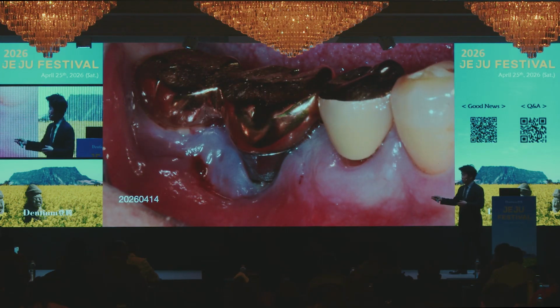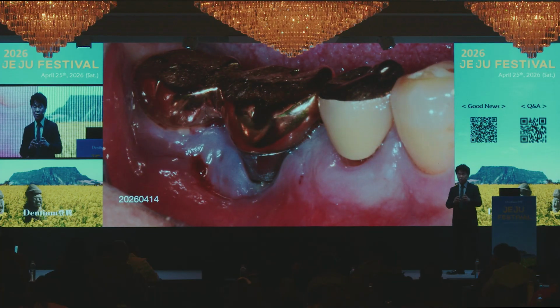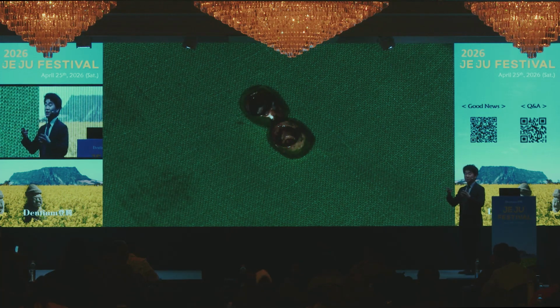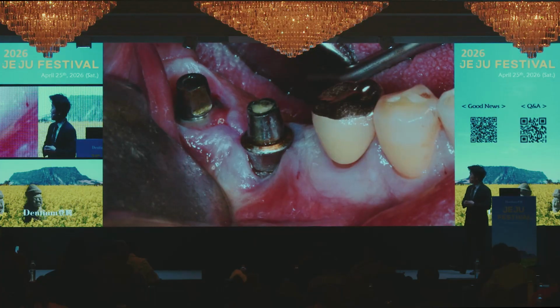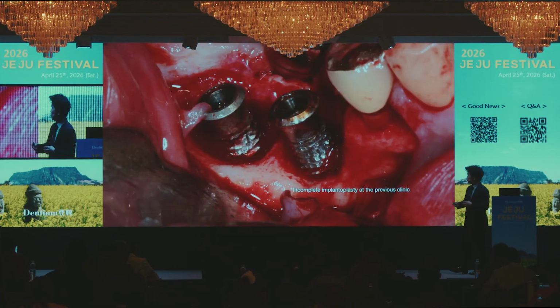So recently, when I do peri-implantitis management for reconstruction, I use this manner. Remove the prosthesis, make the incision, and remove the granulation tissue.